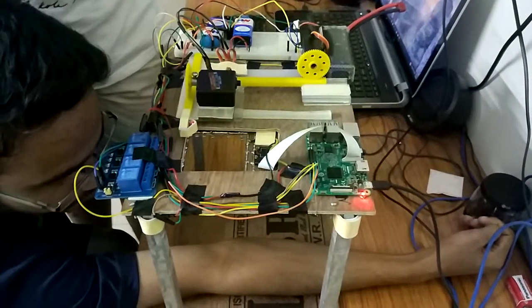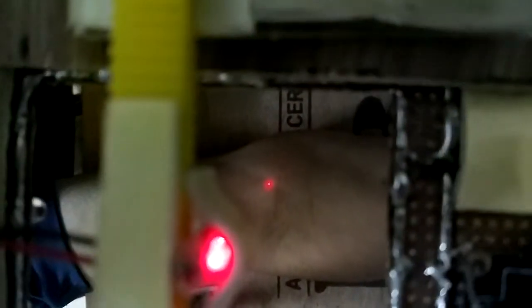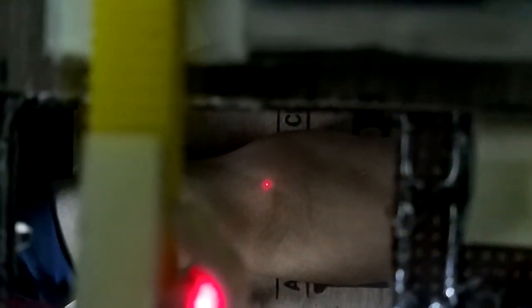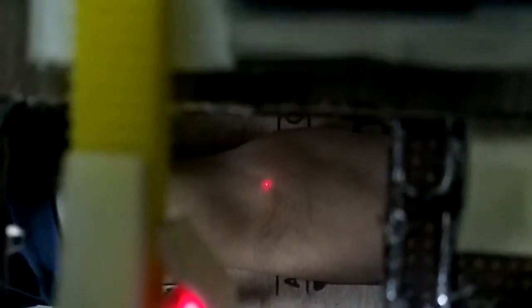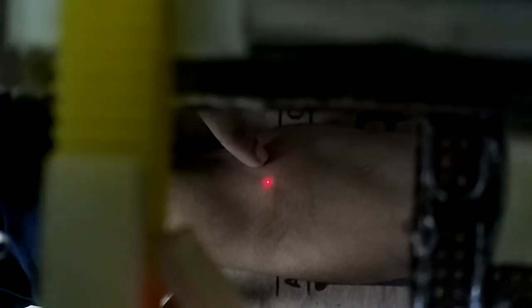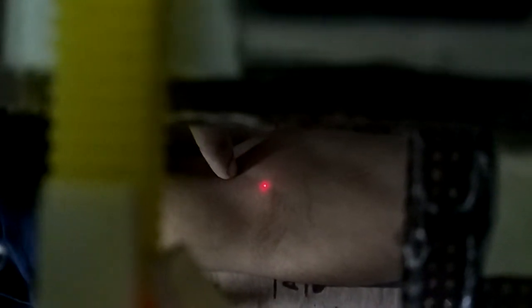The laser pointer is on now. It will move along the X and Y directions, and it has moved and pointed exactly on top of his vein, as you can see. This is his vein here, with the laser pointing exactly on top of it.